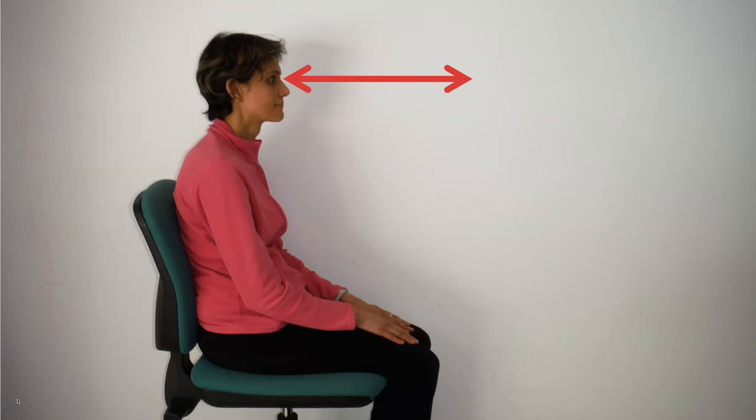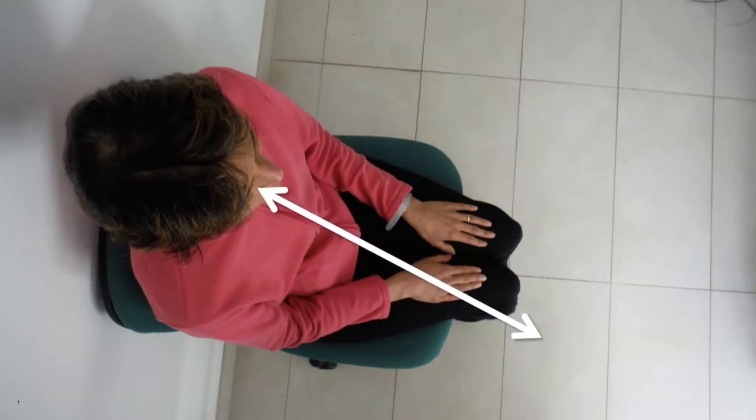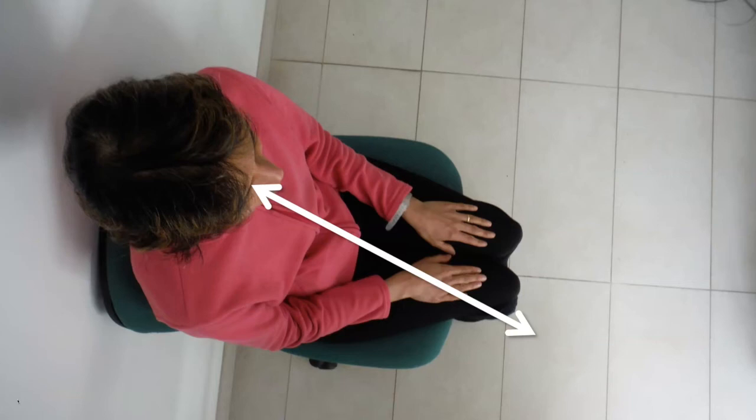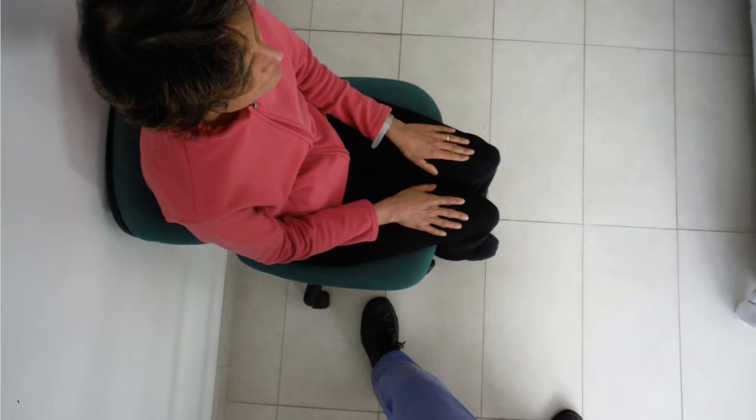You need to triangulate not only your horizontal position but also your lateral position relative to the patient. You need to make sure that you are coming in at an angle of between 20 and 40 degrees to the side of your patient so as to come straight down onto the patient's optic nerve. Having set yourself up in that position, put your front foot level with the patient's thigh and your back foot somewhere comfortable where you are nicely balanced to begin fundoscopy.